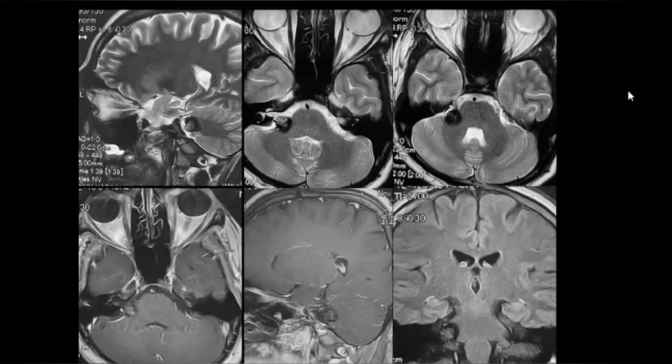Okay, ma'am. On the FLAIR images, it shows again a hypointense rim with central enhancement, with no edema surrounding it. The hypointense rim is suggestive of some chronic bleed, so I'm suspecting some angiomatous malformation. It could be a cavernoma. In association with cavernoma, I would look for a developmental venous anomaly and look for the multiplicity of the lesion.